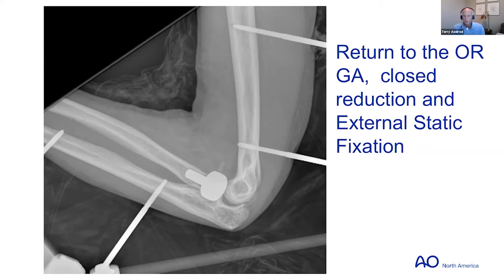In the olden days, when the hinged external fixators were available, we kind of focused on doing that, but they were very, very expensive, and we didn't really like to use them for that reason. And as you mentioned, Jonah, it's hard to get the center of rotation exactly right with those devices, and sometimes you would get it wrong and create more problems than you helped. Whereas with this arrangement, it's just 2 bars, one down the back, one down the ulna. You lock them at 90 degrees, and then you're set to go. So it's hard to do it wrong with this.